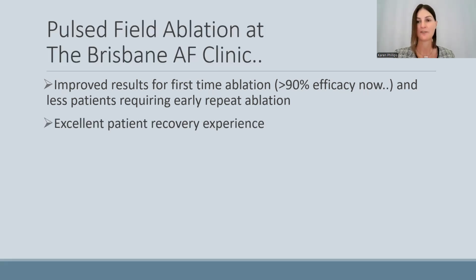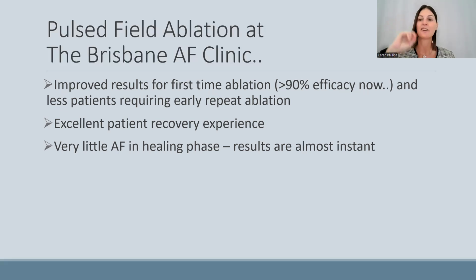Excellent patient recovery experience. As I said, this reduction in inflammation, less pericarditis. Most patients leave hospital the next day and have a very easy time of their recovery. As I said, there's very little AF we've seen in the healing phase, and that means that the results are almost instant. So patients know that they've had a good result from their ablation, and we don't have to wait a couple of months and explain away some of the arrhythmias that can happen because of inflammation and healing before we can see the final outcome.